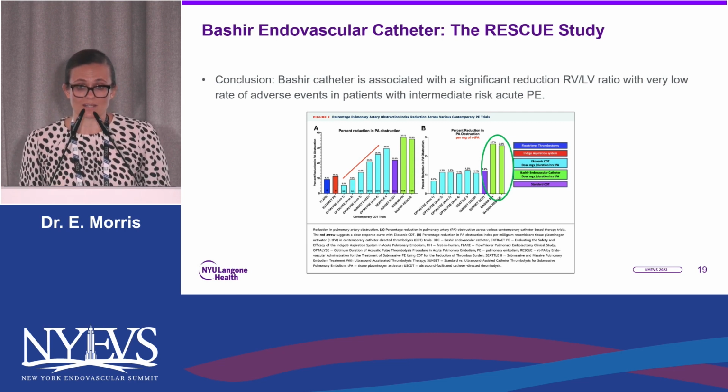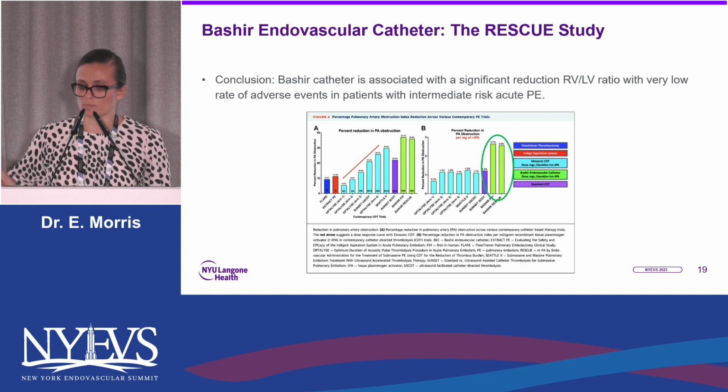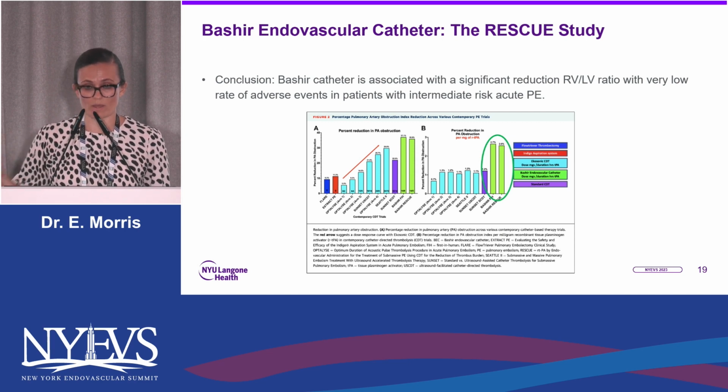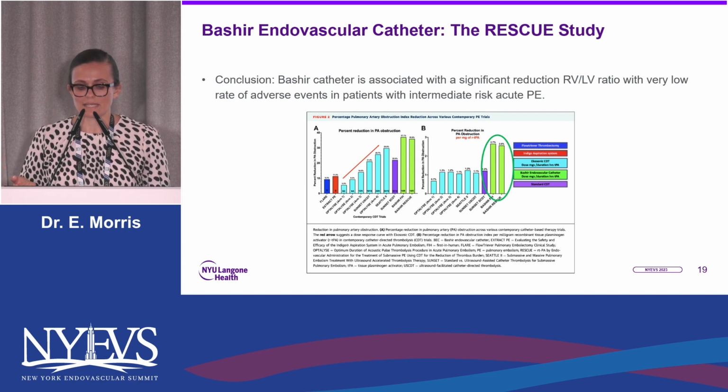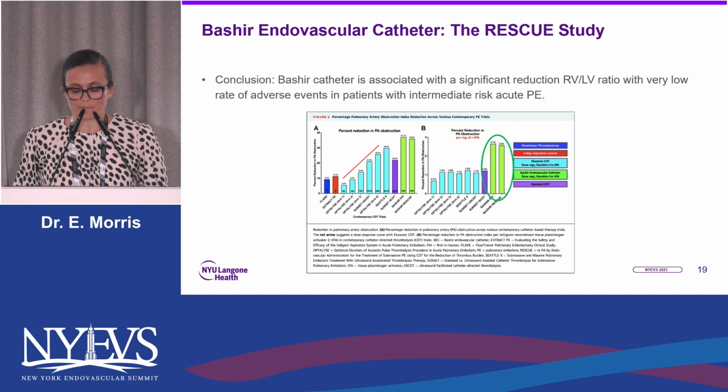Another advantage is that it's a shorter dwell time, which is really nice. You don't have to send the patients back up to the ICU. You can just dwell them in your PACU in IR, take out the catheters later that day. It's a lot more logistically less complex in that sense, which is another reason that this product is desirable or is at least appealing.